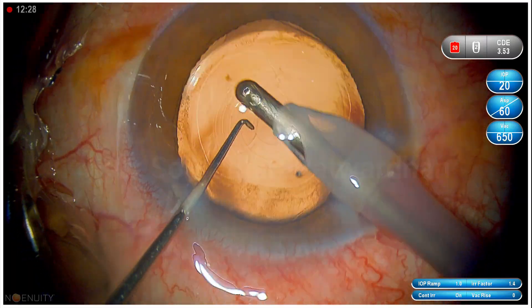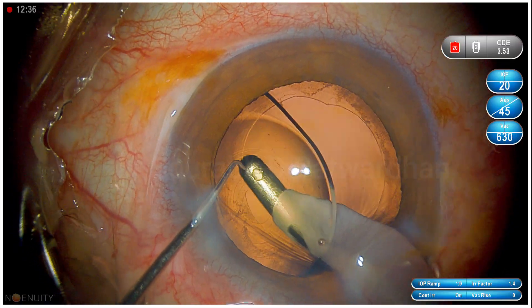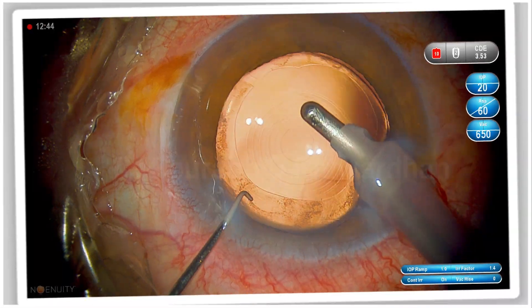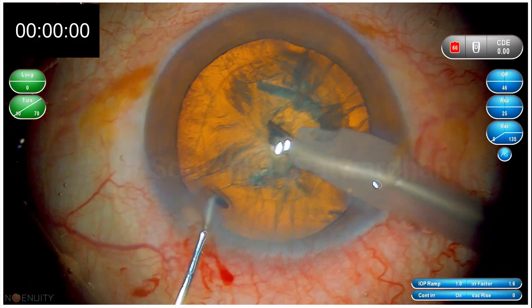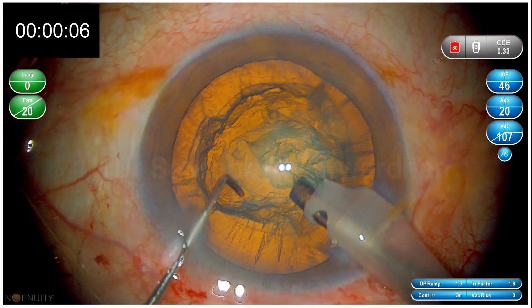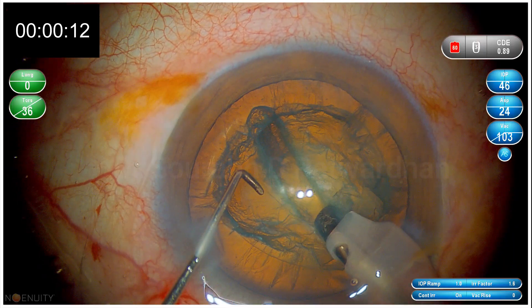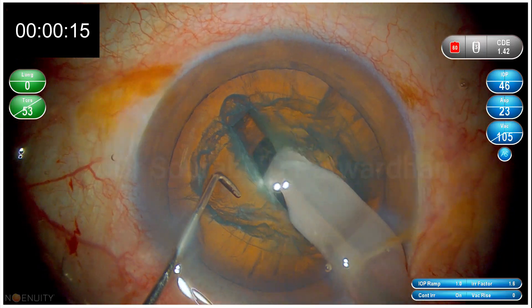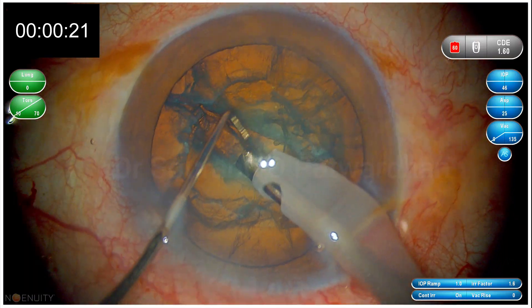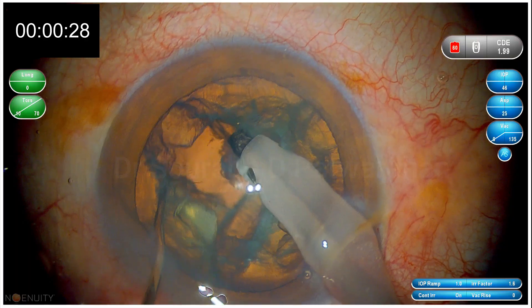As you can see in this case, I could efficiently divide the nucleus and emulsify it just within a minute. The trick is to achieve the right depth with efficient phaco tip strokes, to have complete separation using the chopper in the horizontal position as shown, and then emulsify. Watch this video of the trench and divide technique again and again, including the important steps shown in previous videos, and you can master this technique.